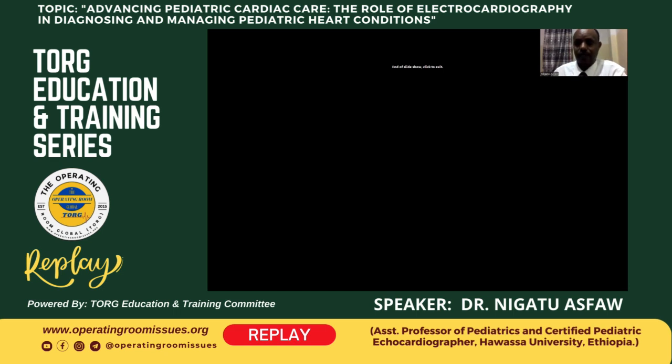If there is hair, it should be removed before the procedure. And if there is movement, that can give us artifacts, which can bring difficulties in the interpretation of the ECG. And as I said in the presentation, limb leads can be put proximally around the shoulder in young children, which may move during the ECG-taking procedure.